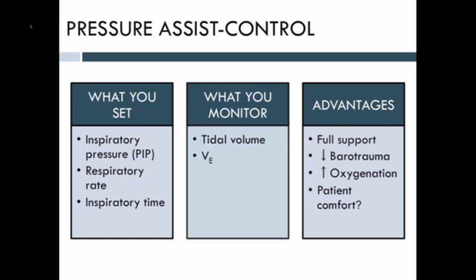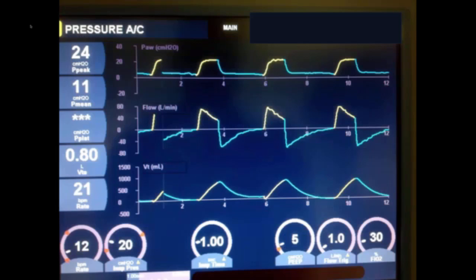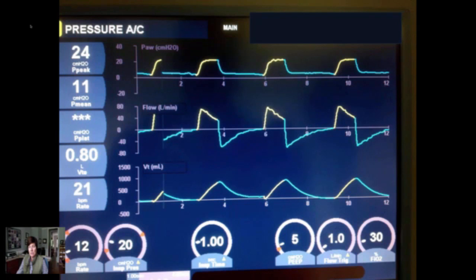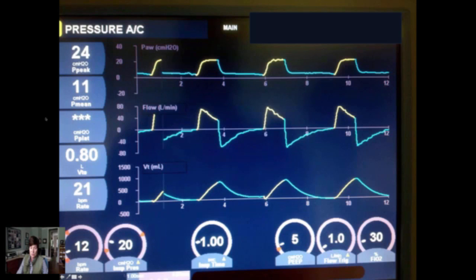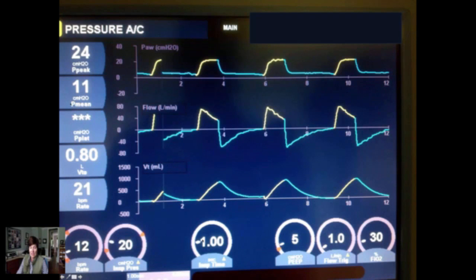Let's take a moment to review what the waveforms look like for pressure assist control. This is again a waveform from a transport ventilator. We've set a rate and the patient is breathing a bit higher than that. Instead of setting a tidal volume, we have set an inspiratory pressure — that's the 20 in the second dial — giving 20 centimeters of water pressure for one second. During that one second, the patient receives a tidal volume, which in this patient is about 800 mLs.